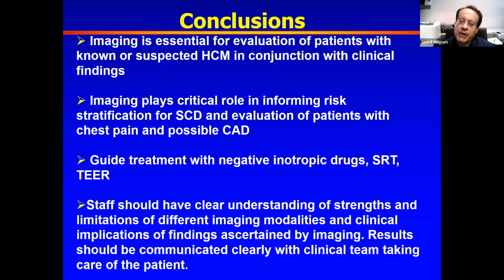If you see it, and you can see it by M mode, by 2D, by color Doppler, then it is present. Why is it present in these cases? It's primarily because of mitral valve apparatus changes. Sometimes it's not just an anteriorly displaced papillary muscle, it's an anomalous papillary muscle as well, along with the elongated leaflets of the mitral valve relative to the ventricular size.